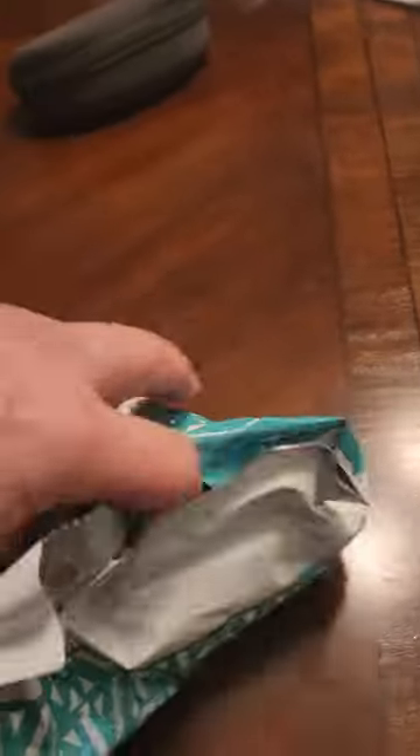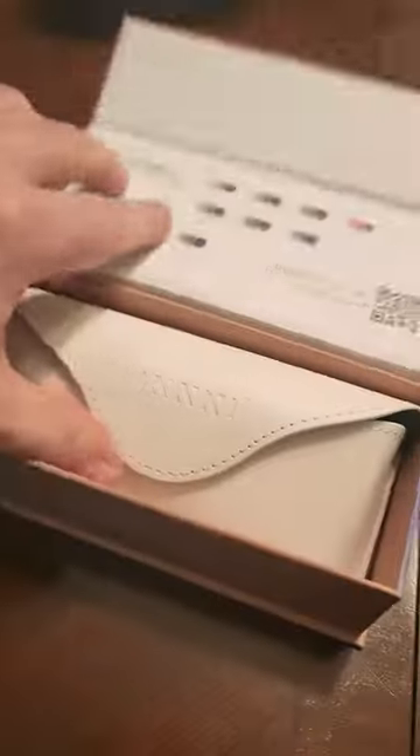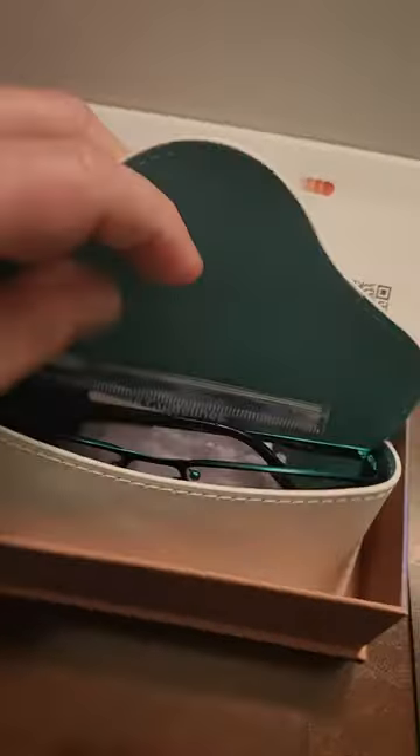How to make your new glasses fit better. Alright, you got your new glasses, you just ordered them. They don't fit right — the ear right there. What do you do?